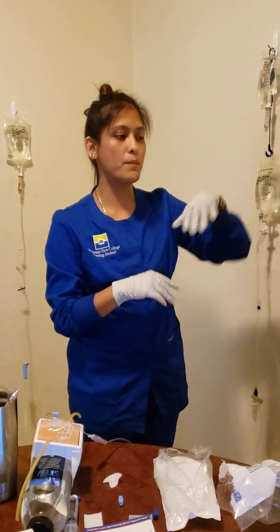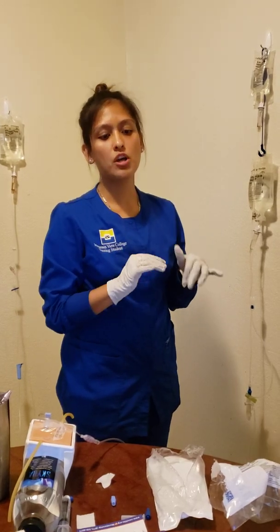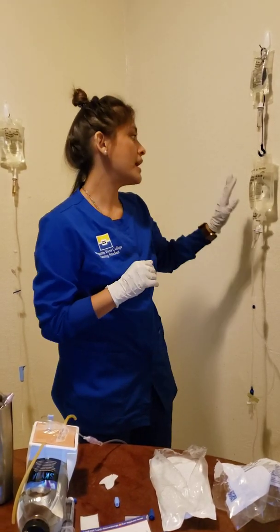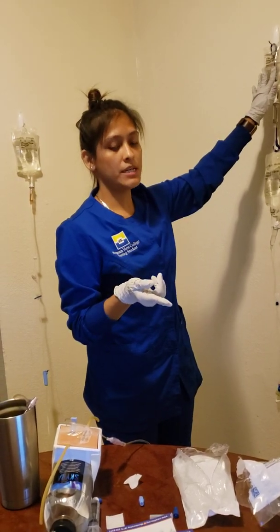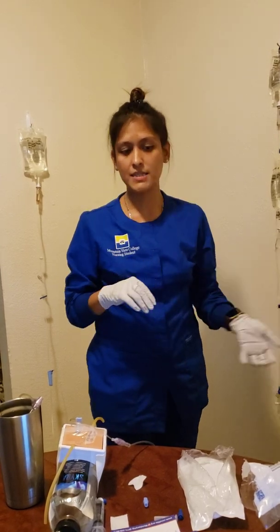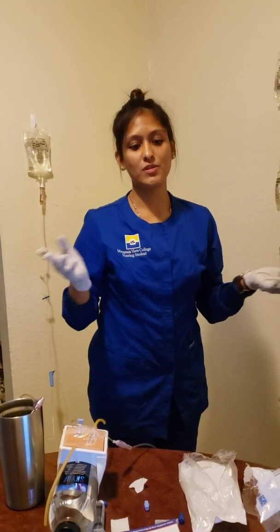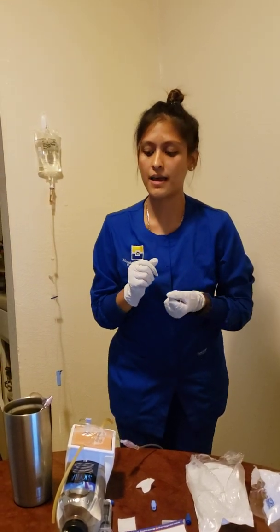She's connected to her monitor, so everything's good. And so I just want to document, and as I'm documenting, I'm assessing Miss Chi, making sure she's taking these meds in great. And I want to document that I'm giving my 500 ml of saline and my 500 mg of ampicillin, and that she is tolerating well, that the IV site flushed well, and that it's in her right AC. And that's all I'm going to document. And so that I would perform hand hygiene, say my goodbyes, be back in 30 minutes, and that's it.